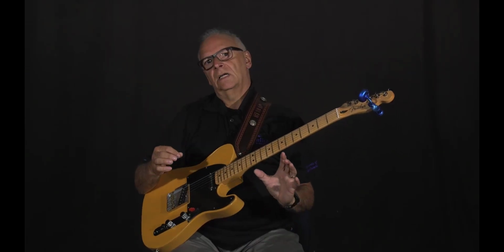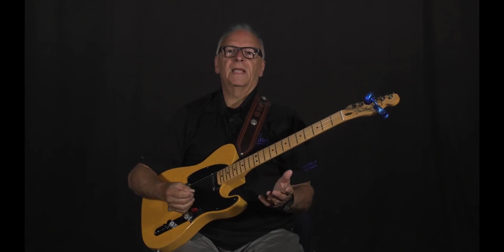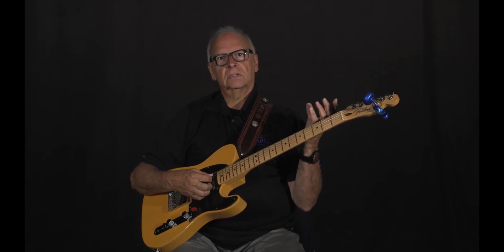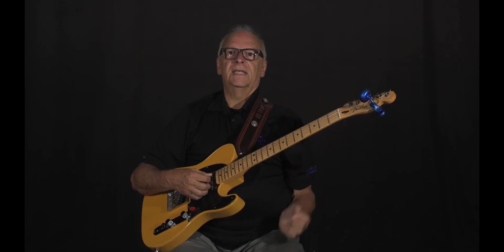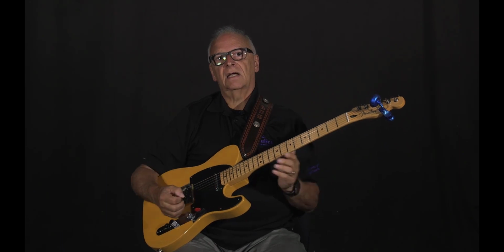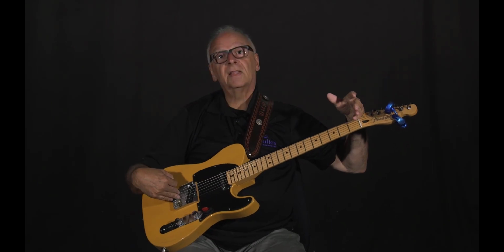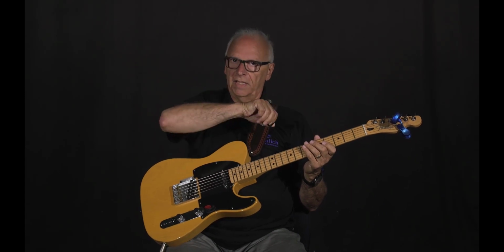The harmonics are sounds that are produced when you strike a string. And when you think you're only playing one string, for example, if I play this string, you sort of hear the main note or the main frequency. But in addition to that, there are multiple frequencies in integer amounts that also are sounded, but you don't hear them quite as loudly. So the first harmonic actually has a wavelength and frequency that's between this part of the guitar and this part of the guitar. So the entire string is basically wobbling up and down this way. That's your first frequency. That's the primary note that you hear.